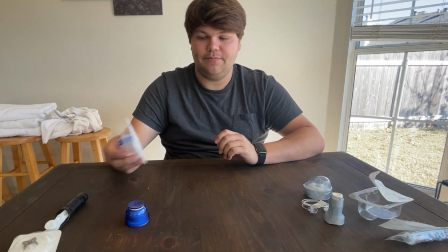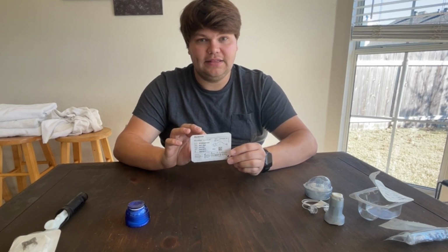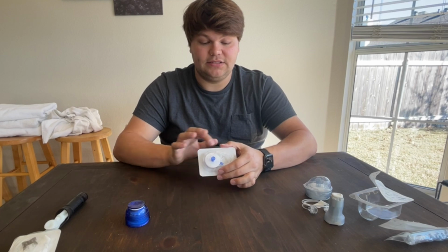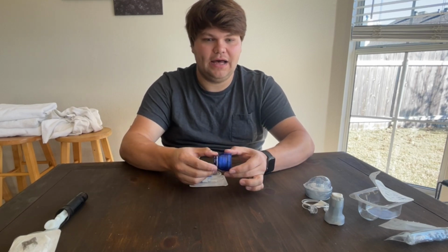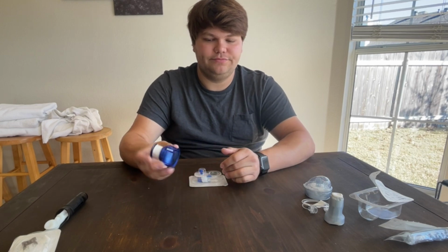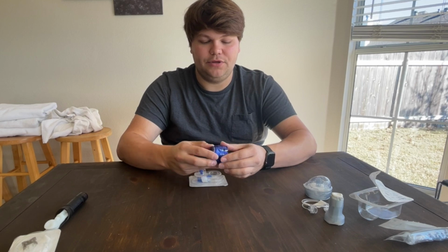The next type is the Medtronic MiniMed Quick Set. I like this because it is the infusion set and the tubing, but the downside is you have to buy the inserter. You can get these from Medtronic. You do have to purchase them.